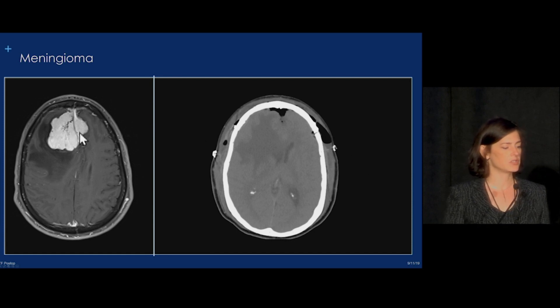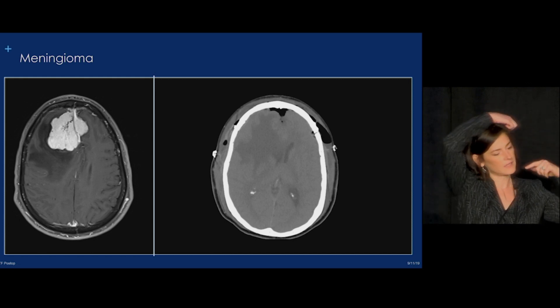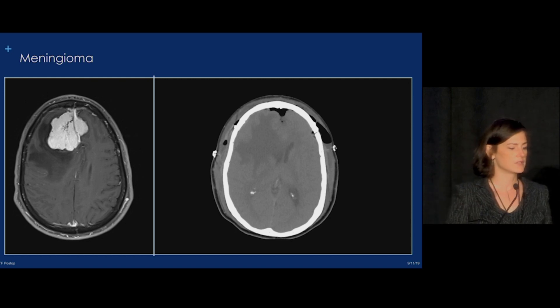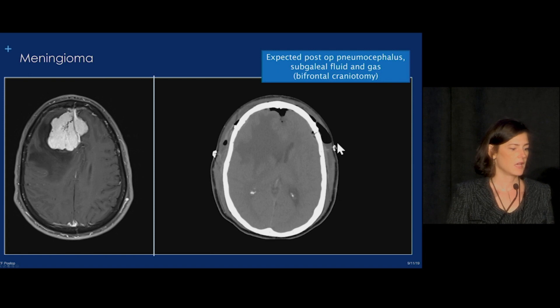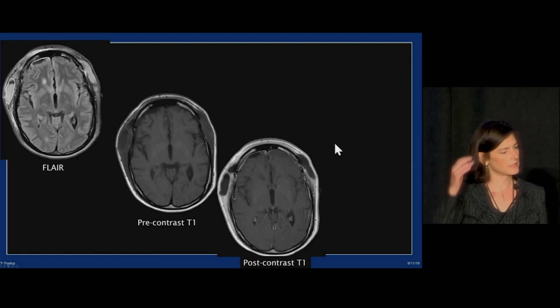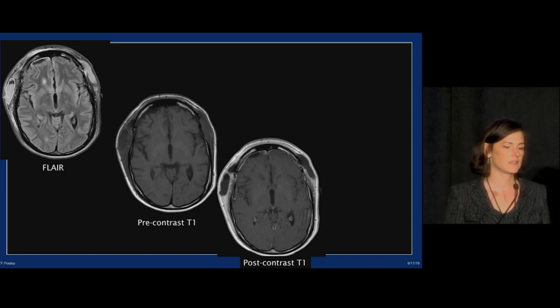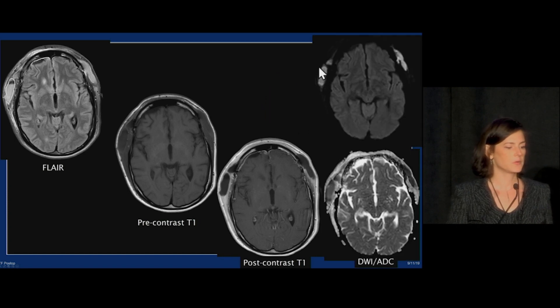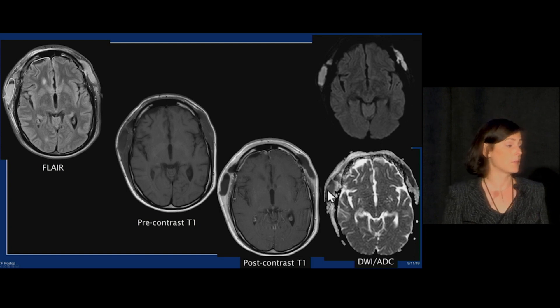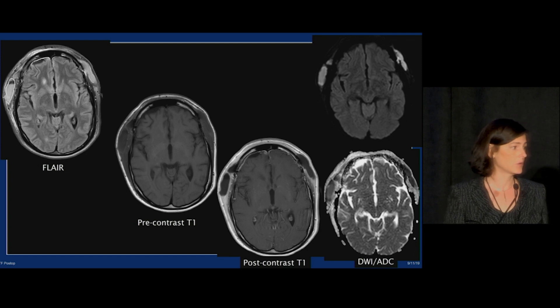Here's a patient who had a frontal meningioma with a lot of vasogenic edema that was resected. This required a very large scalp incision — a coronal incision ear to ear — and a large skull flap pulled anteriorly. On the postoperative film, we see pneumocephalus and a fairly extensive subgaleal collection containing gas. This is normal after a skin flap of that size. However, the patient came back with a fluctuant collection under the skin flap. MRI showed bilateral enhancing collections. DWI was very helpful — these collections were bright on DWI with ADC signal dropout, tilting us toward infected collections. When they took the patient back for washout, this was pus.